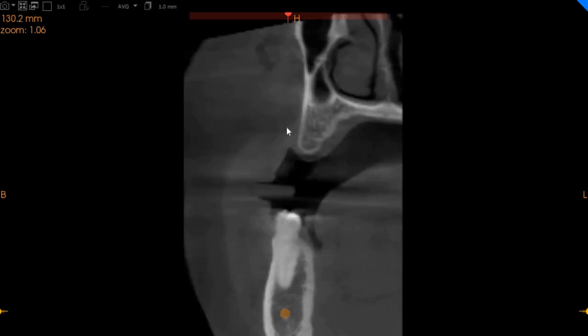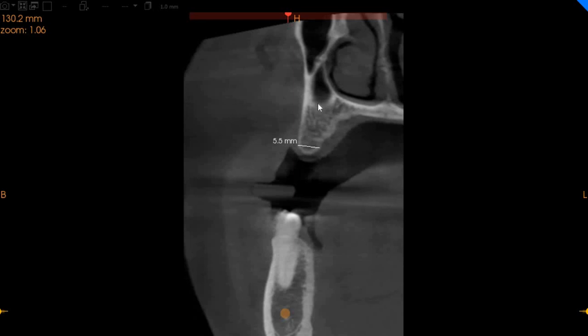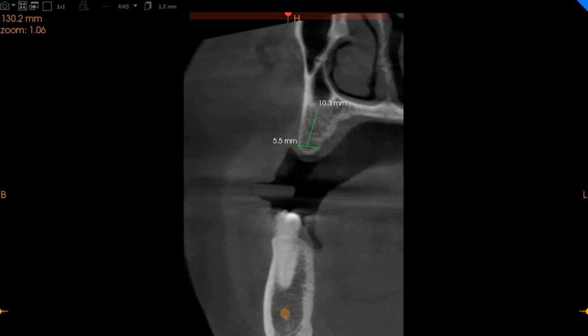And in the second premolar region, we've got approximately 5.5 millimeters of width and approximately eleven millimeters of height.